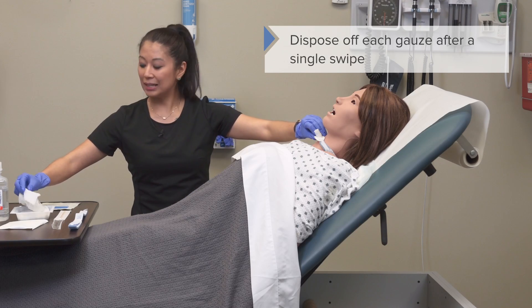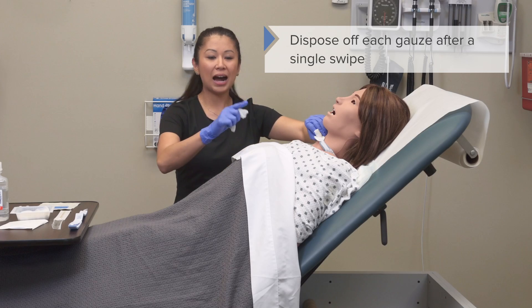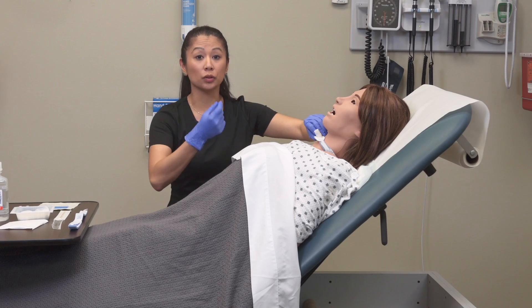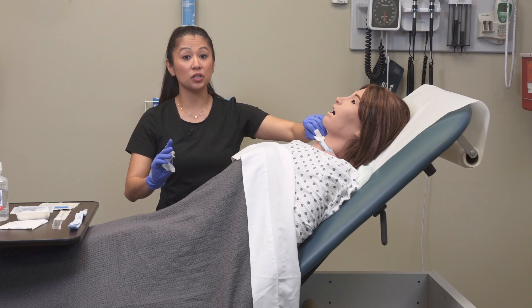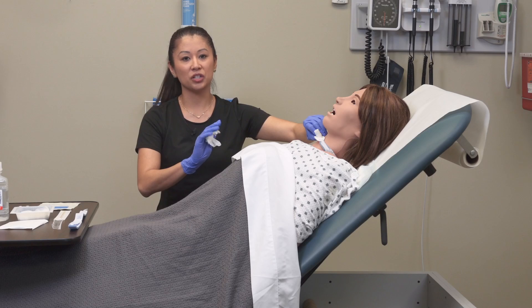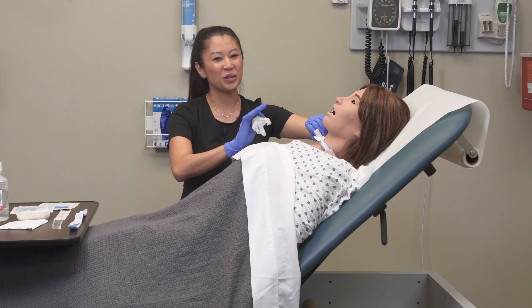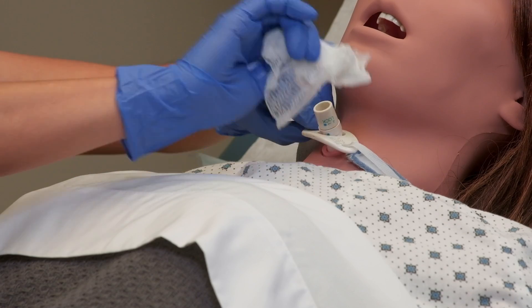You'll notice it's really up to your comfort level and whether you have help — I've left the tracheostomy holder on just to stabilize. If you have a partner to help stabilize, it makes it much easier. But the key thing here is we don't want this to dislodge. Let me take down the other side of the flange and clean thoroughly.